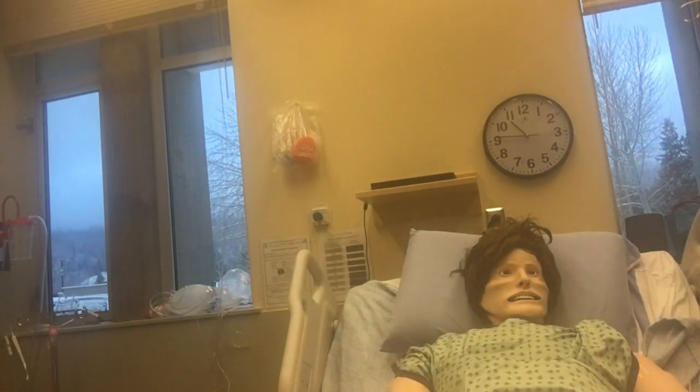Okay, so starting my third one, or second one, I guess, for a dressing change with Kendall Barker. I'm going to go into my client's room right away and introduce myself and assess for factors and the need for pain. So entering the client's room, I'm going to perform hand hygiene for some privacy.